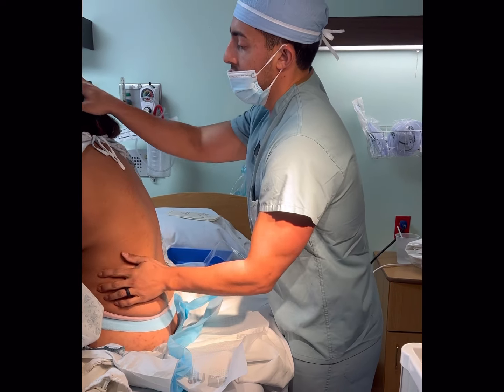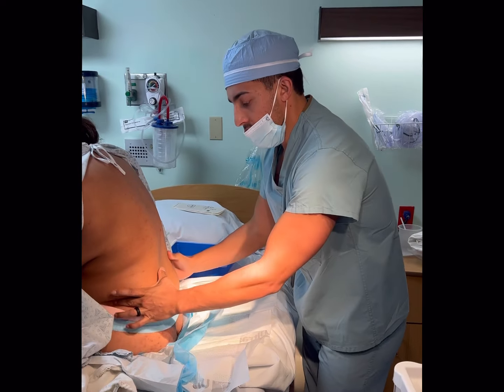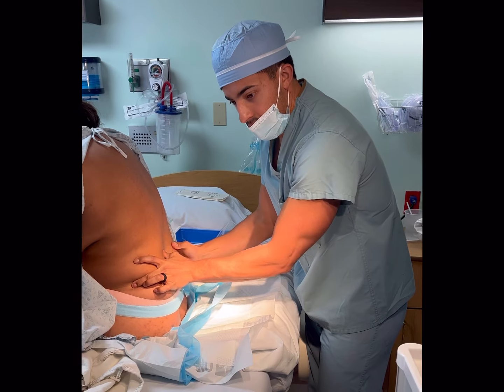Relax your back. Relax. Chin to your chest. So I'm feeling her iliac crest here, and this is Tuffier's line.